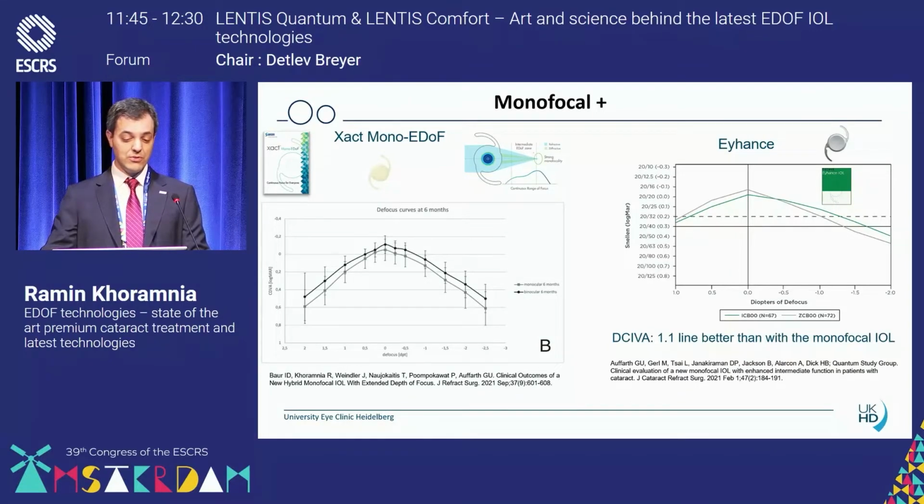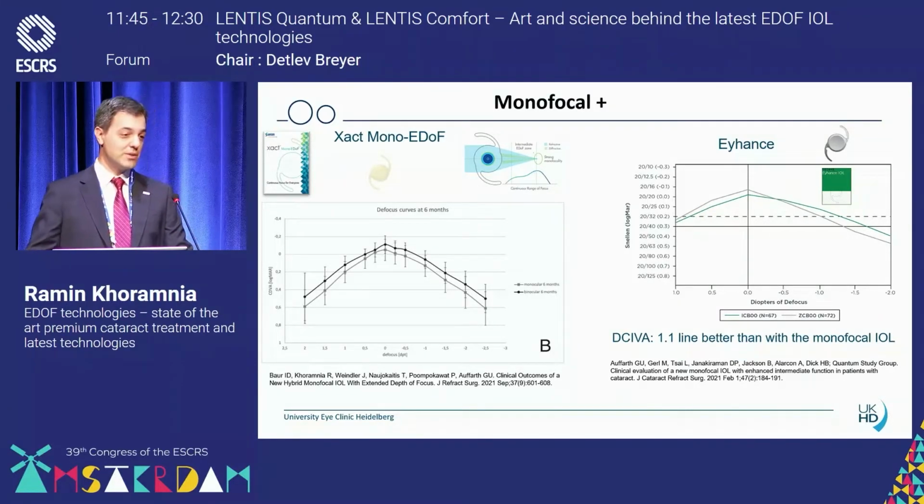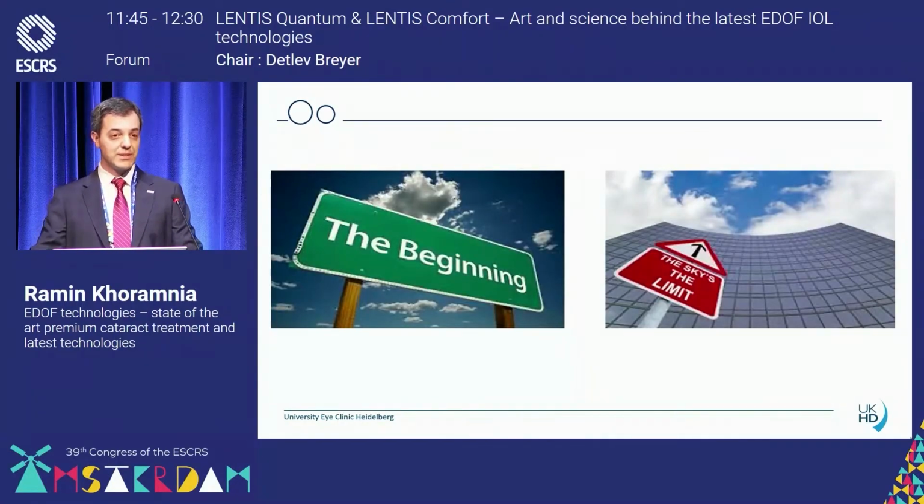Teleon also has a new monofocal plus lens now on the market, which is called the Quantum, and I'm very interested to hear now in the following talks about this new intraocular lens that we will now be able to use in our clinical practice.